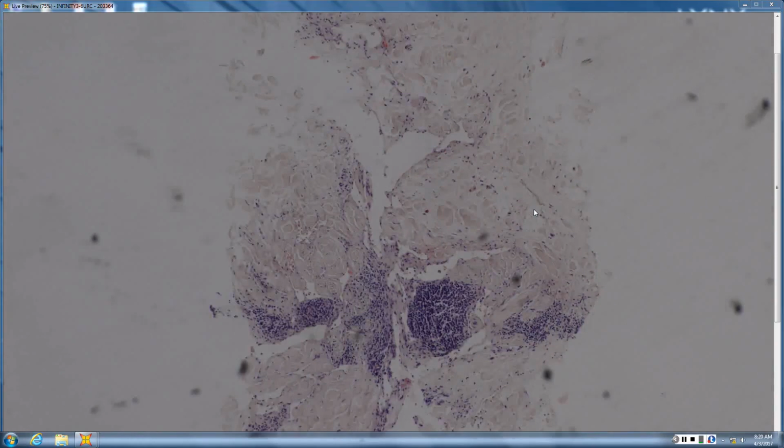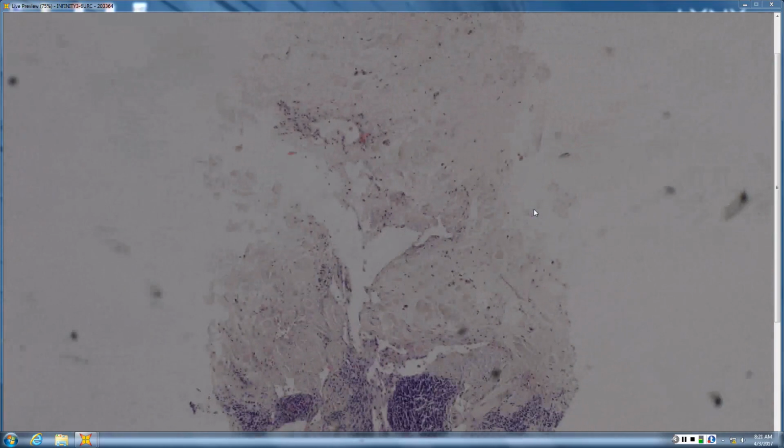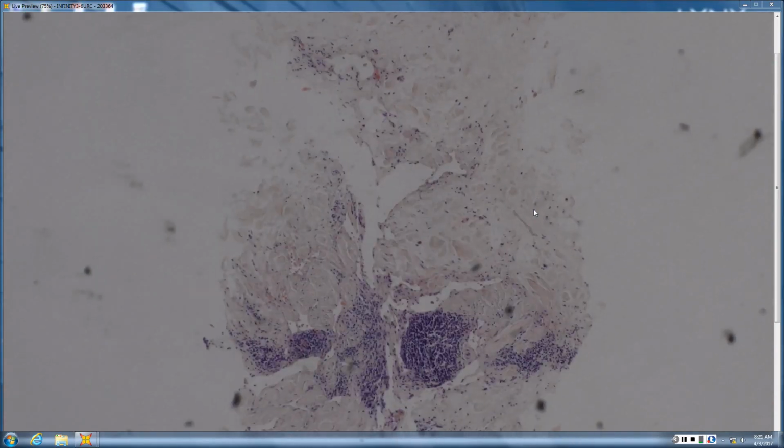So there's definitely a vascular proliferation, both superficial and it looks like deep, and there's nodular lymphoid aggregates, which always raise my suspicion of something not good. Yeah, and this is on the chest of someone who's had a mastectomy. So I'm already at atypical vascular lesion, and I would want to know if she's had radiation, and if she has, I'd probably do a CMYC to make sure that it's not a radiation-induced angiosarcoma.